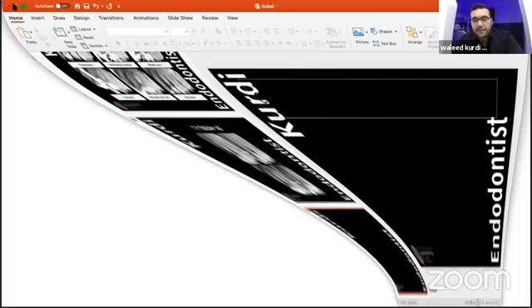Muad, how to detect the deep split and the best way to obturate? I detected the deep split in this case just with magnification and scouting with the small K files.